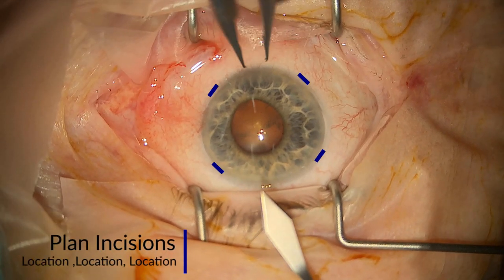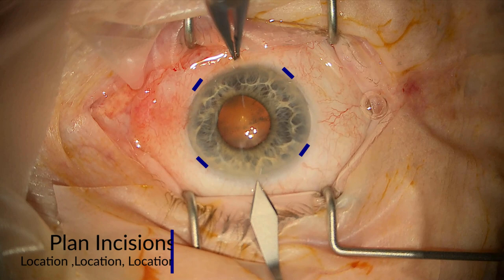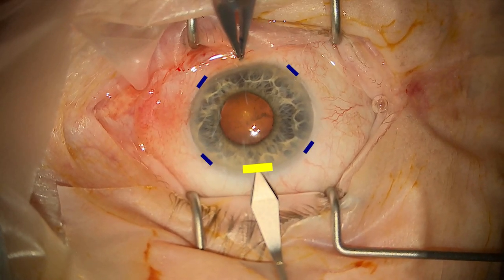My first top tip is to think about location. You can see I tend to try and go for four iris hooks, and therefore I make sure I put my main incision at about 12 o'clock so they're away from the iris hooks.